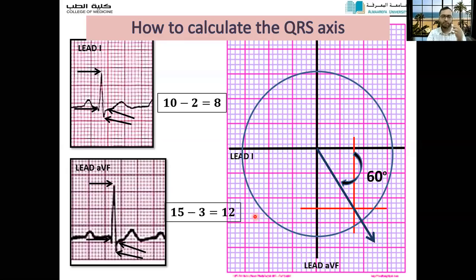But this is a theoretical method. Hardly anyone uses this method on the clinical side, at the bedside of the patient, because it consumes too much time. Although it gives us the accurate axis of the ECG, it takes too much time.